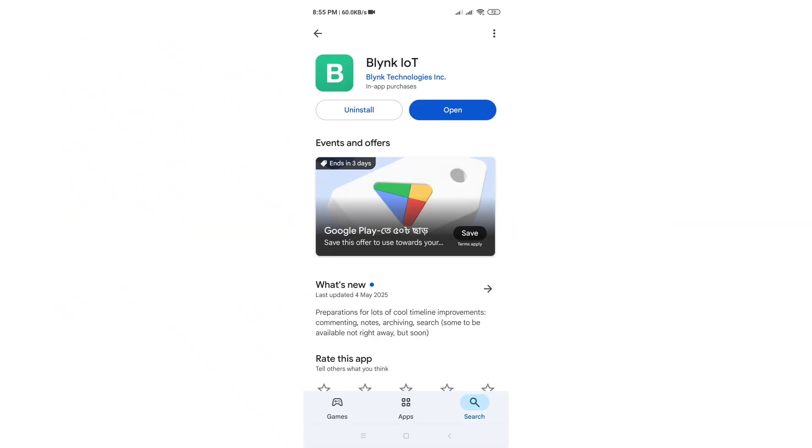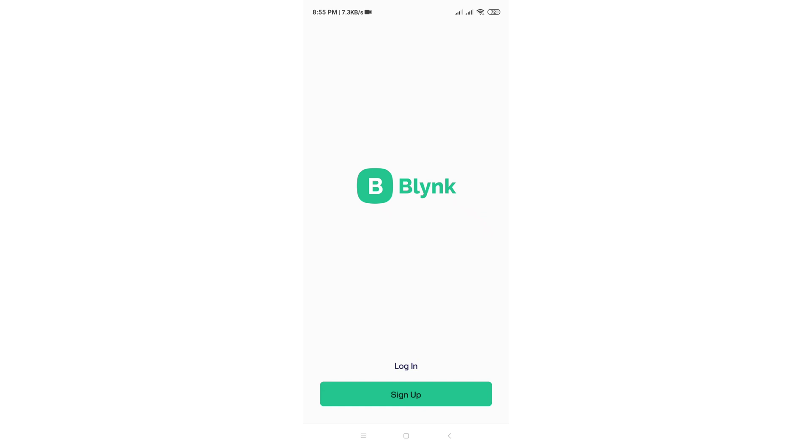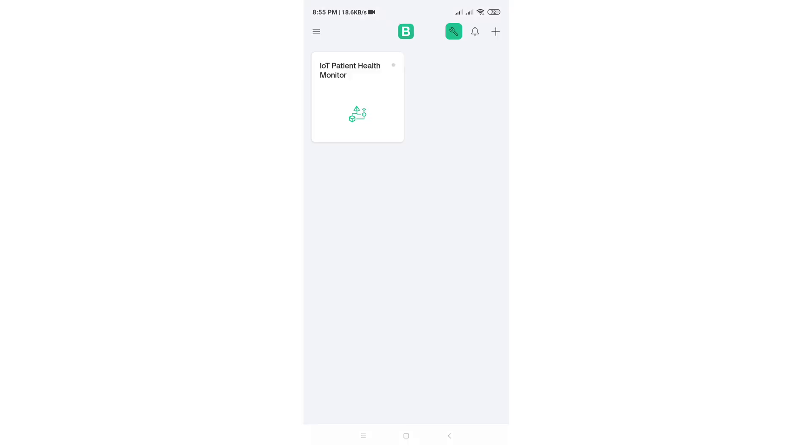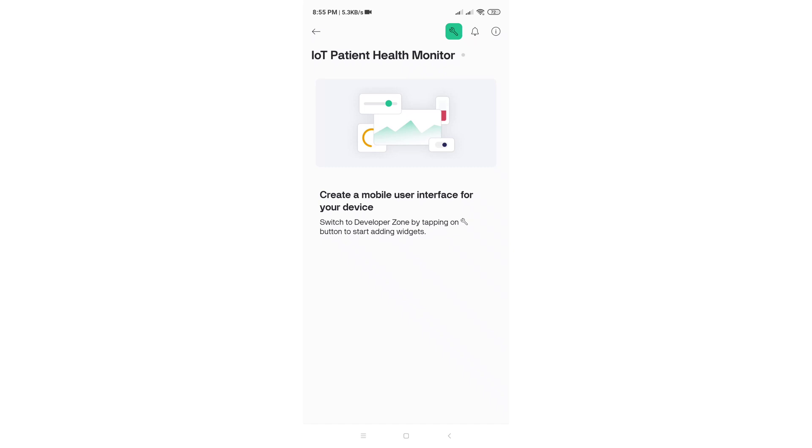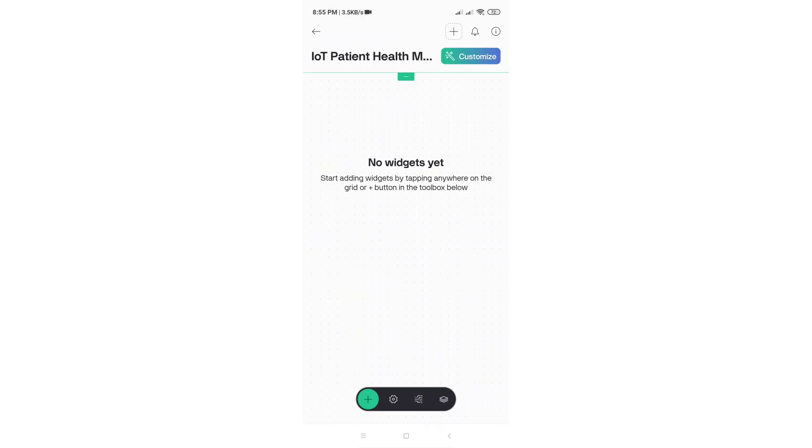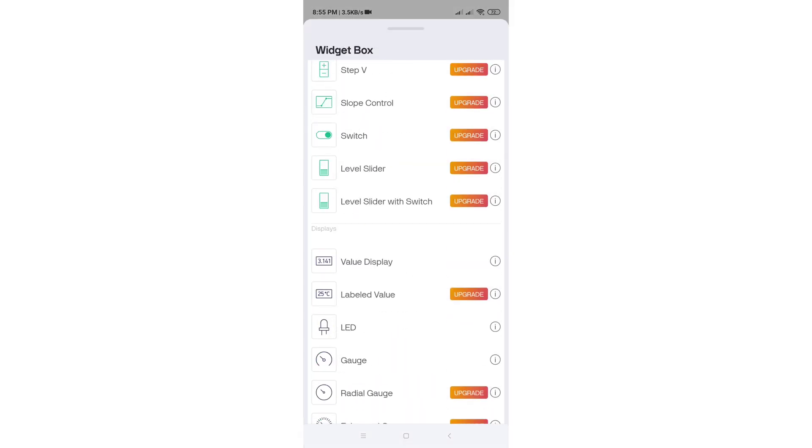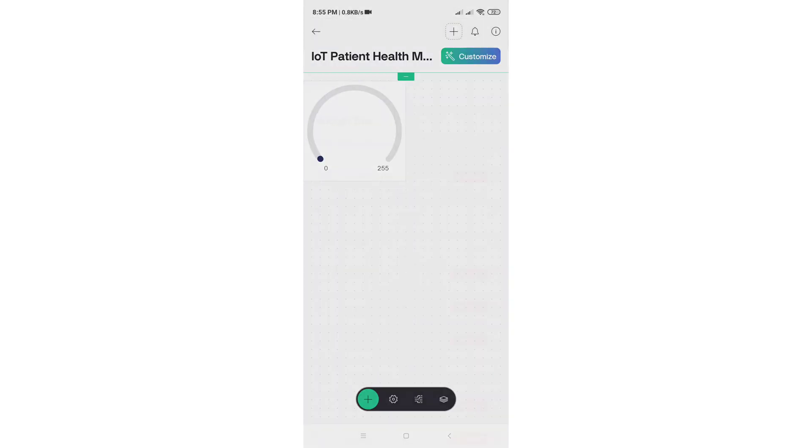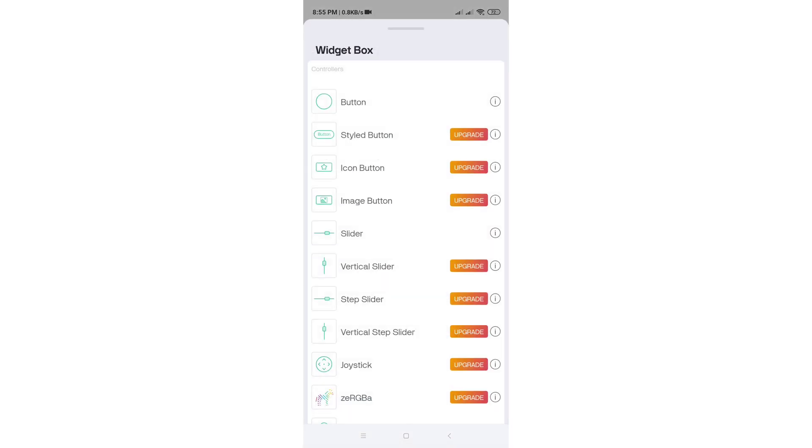Next, we need to set up the Blink mobile dashboard. Install the Blink IoT app from the Play Store and log into your Blink account. Create a new dashboard with four gauges and link them to the same virtual pins used in the web dashboard.